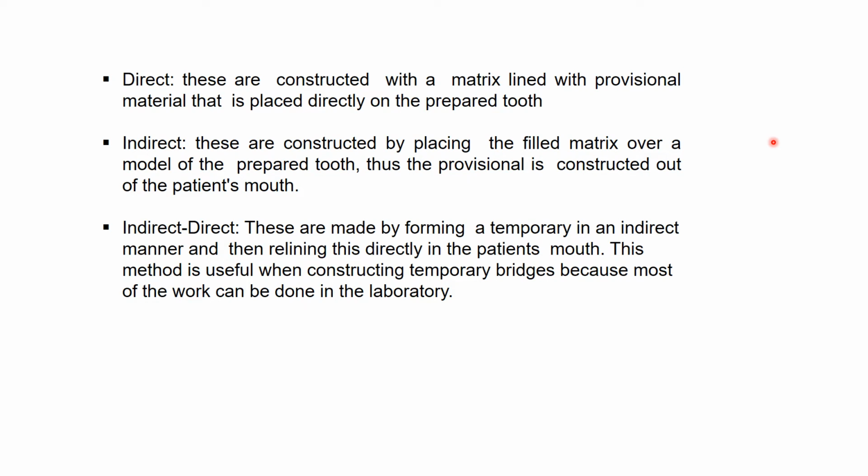Corrected and cemented, or relined and cemented. Indirect-direct: these are made by forming a temporary in an indirect manner and then relining it directly in the patient's mouth. This method is useful when constructing temporary bridges and when you're sending a bulk of work to the lab.